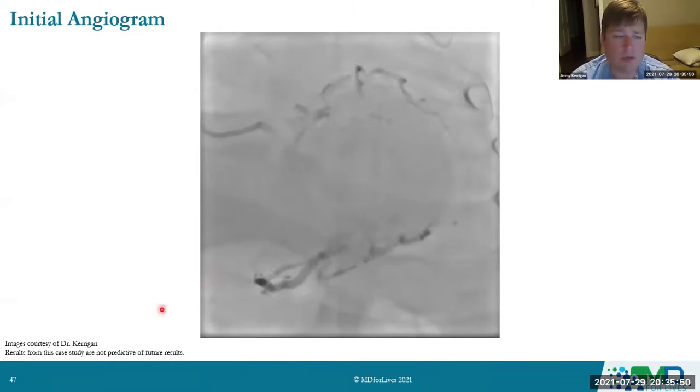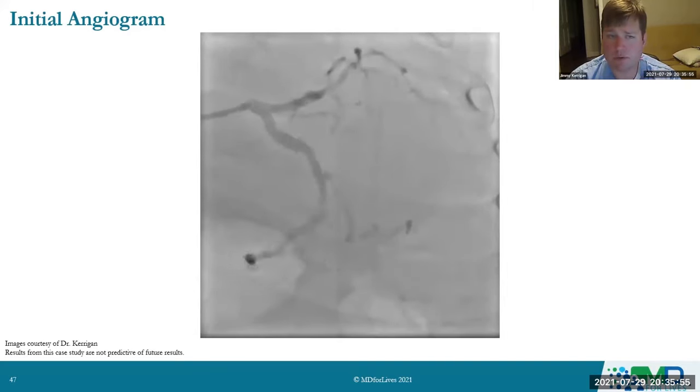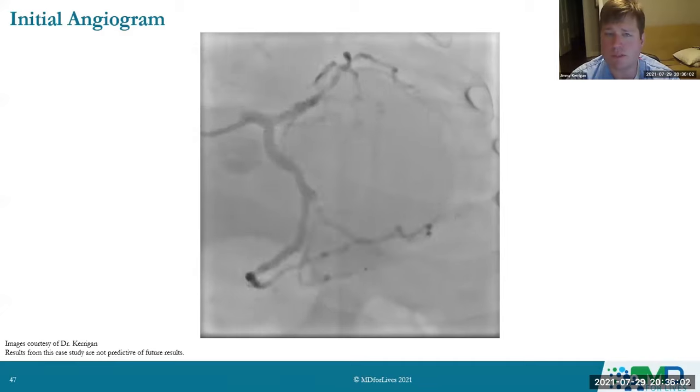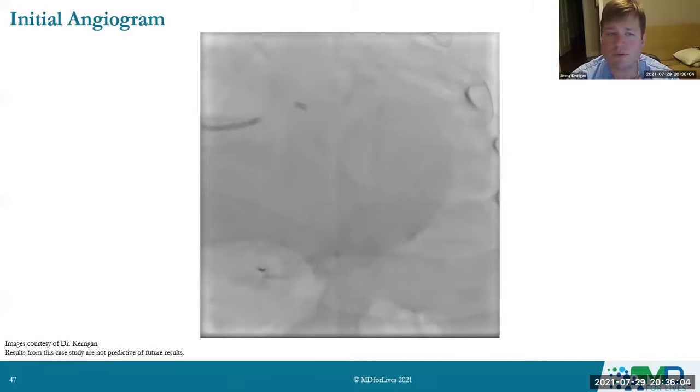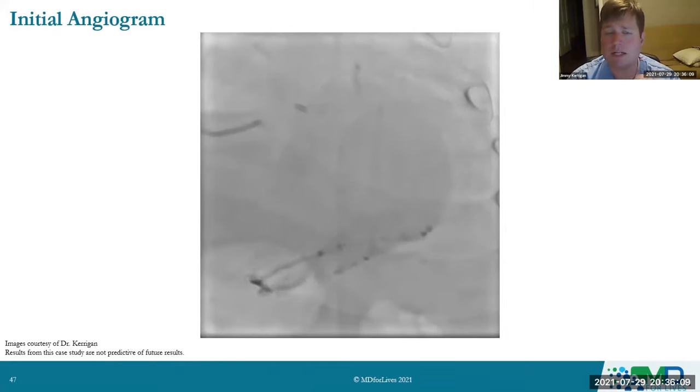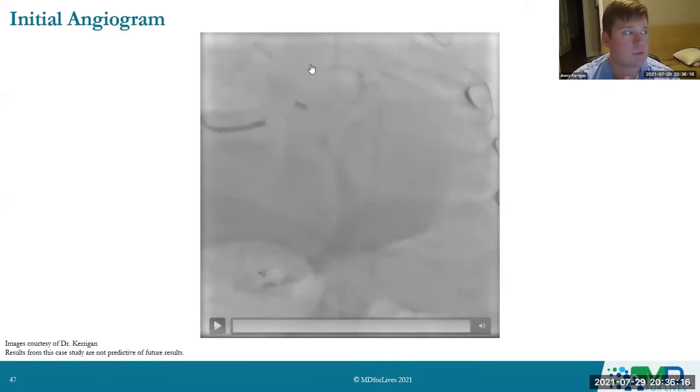We know from the COMPLETE trial that complete revascularization provides a mortality benefit to patients. So you come in with a STEMI, an acute MI, and whether or not the culprit lesion is fixed, fixing the non-culprit lesions that are significant and angiographically severe is beneficial. We know now from the FLOWER-MI trial, which was recently released, that FFR guidance does not help. I still use resting physiology like iFR to help me guide those decisions. I just don't think that the use of adenosine is appropriate in a general population, or a STEMI population, excuse me.